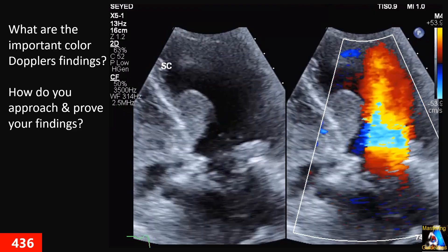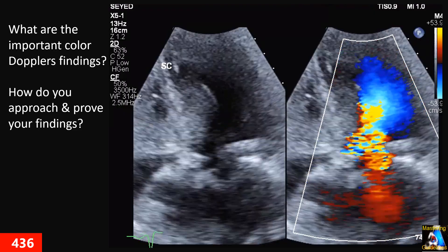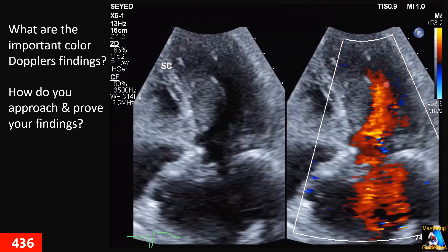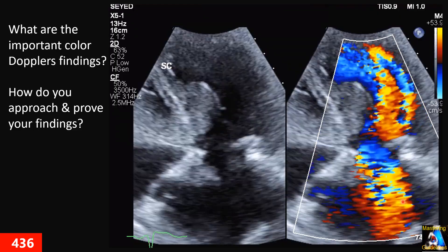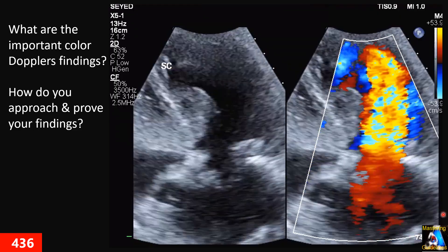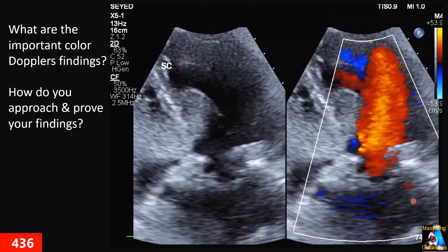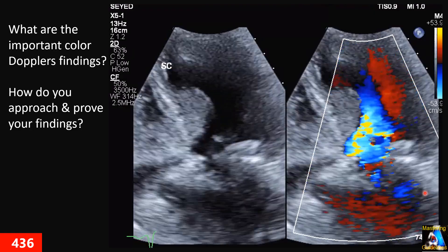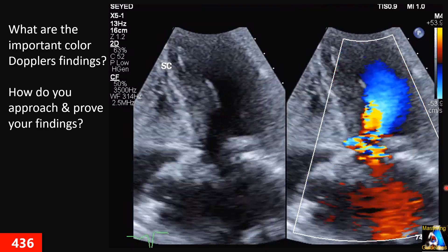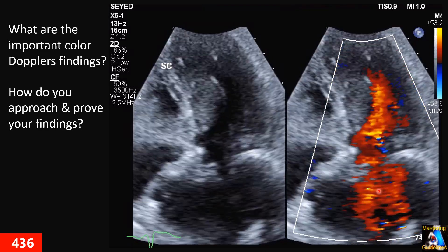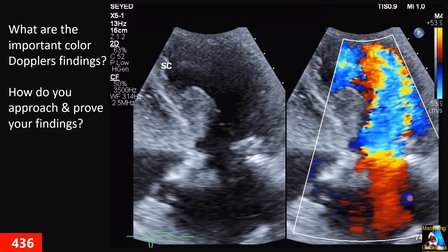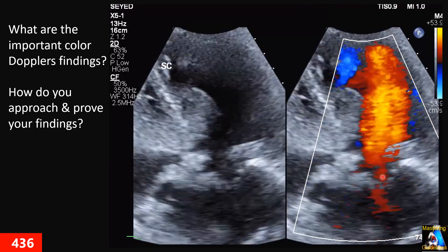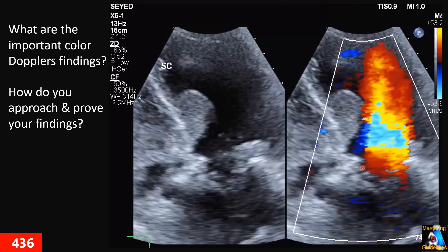Now you go to apical four-chamber view and you put color at the left ventricle all the way. You will see two abnormal color Doppler signals. What are those? First and second — those important color Doppler findings. How do you prove your findings? What should you do and how do you show it?